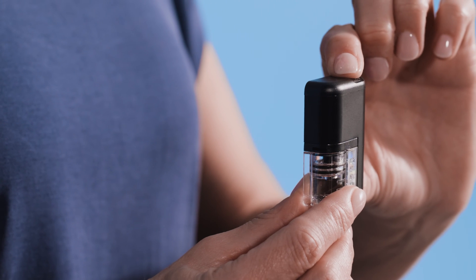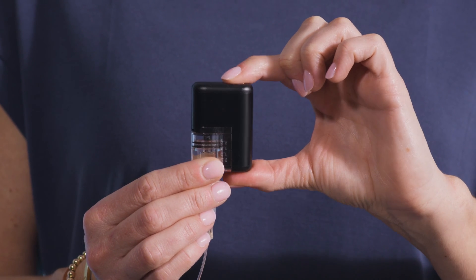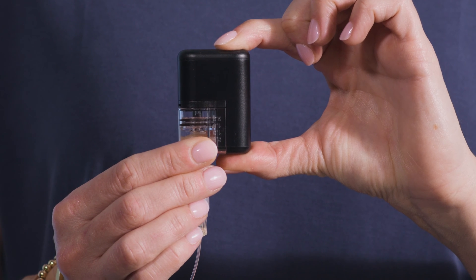Now it's time to deliver a quick bolus. Start by pressing the pump button. You'll either hear two beeps or feel two vibrations depending on your sound settings. Then simply press the pump button once for each increment until the desired amount is reached. Each time you press the button you will either hear a beep or feel a vibration depending on your sound setting.